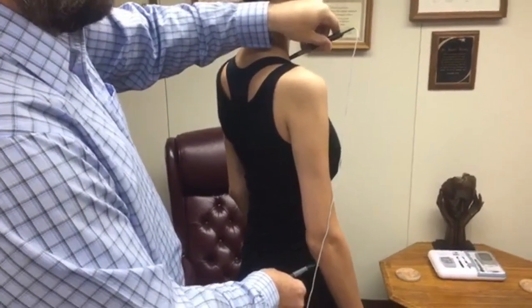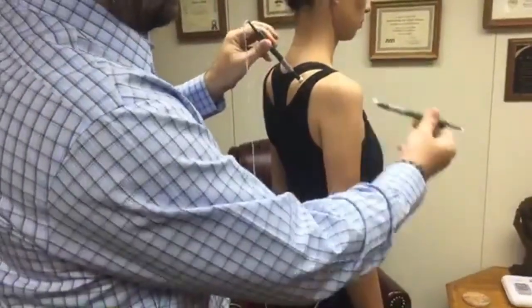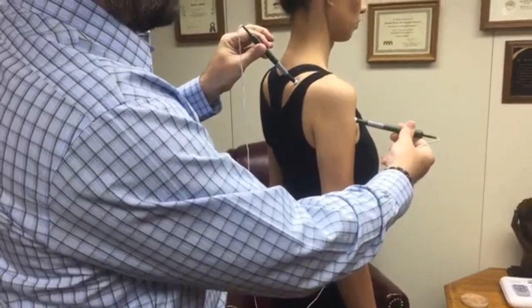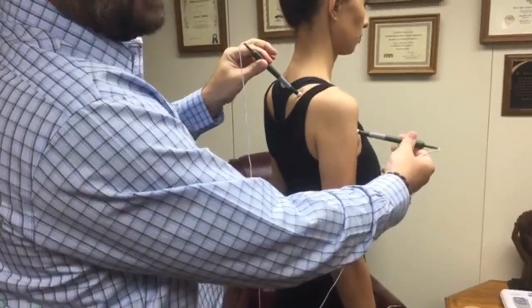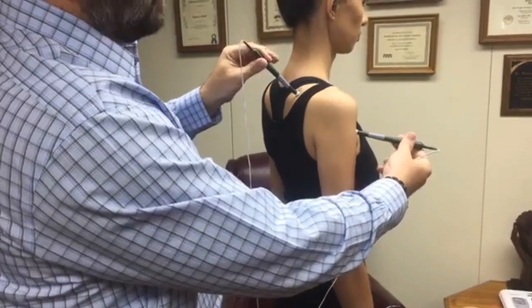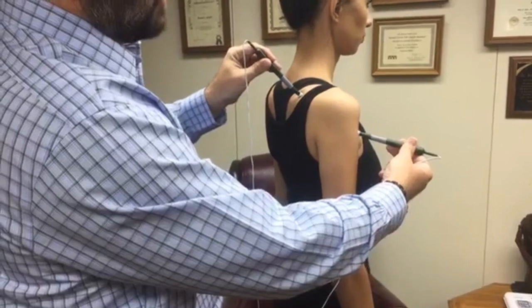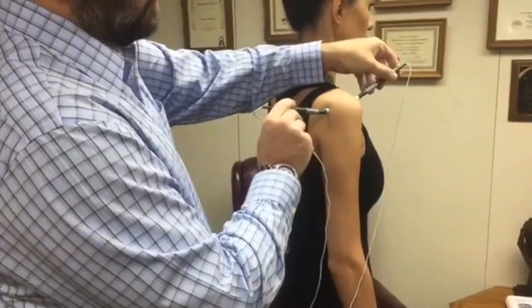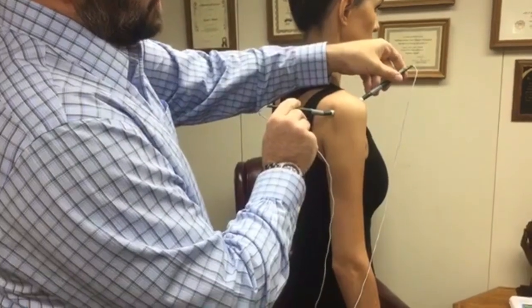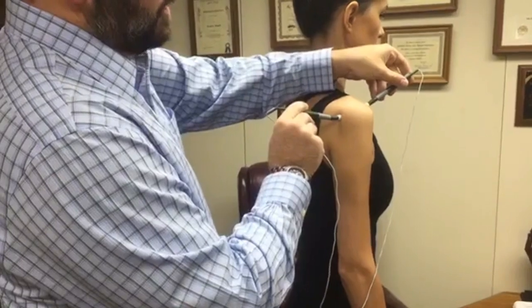Step two is a small star — we're moving closer to where her pain is. All we're doing is directing the current through her pain. You can see the plane we're in here: anterior, posterior. It doesn't really matter where you put the probe as long as you're connecting point A to point B and your current is traveling through your pain. Now we're just moving around at different angles, right through the joint — 10 seconds at a time. So it moves very quickly.